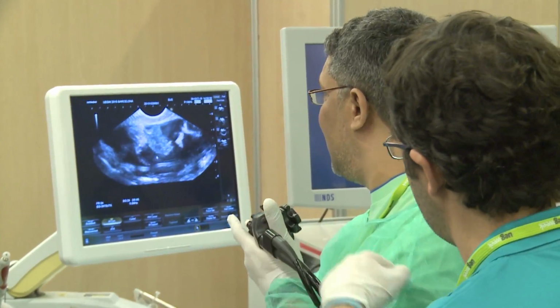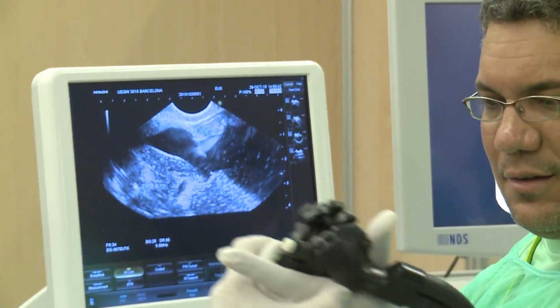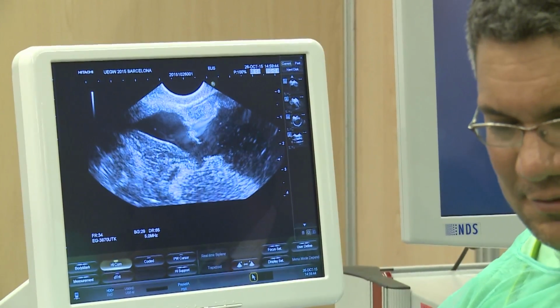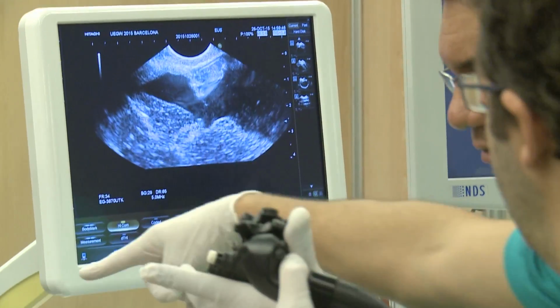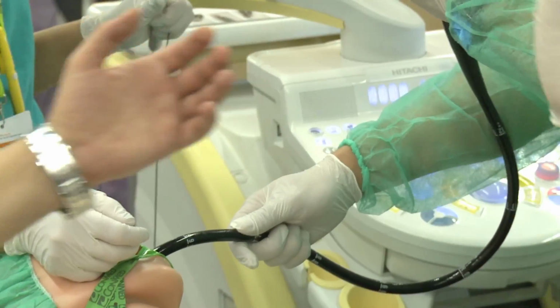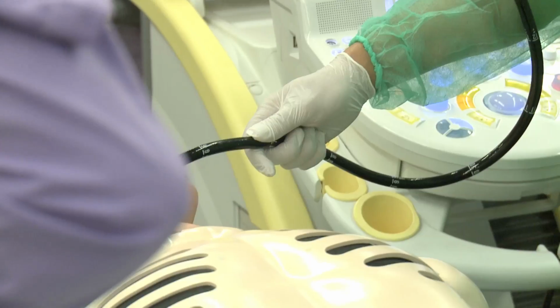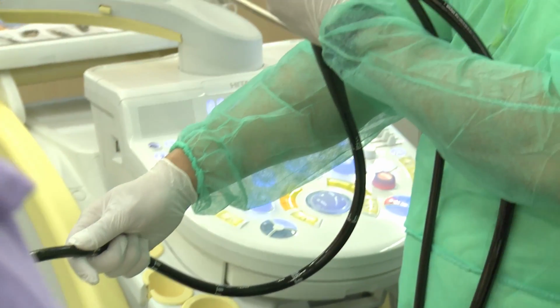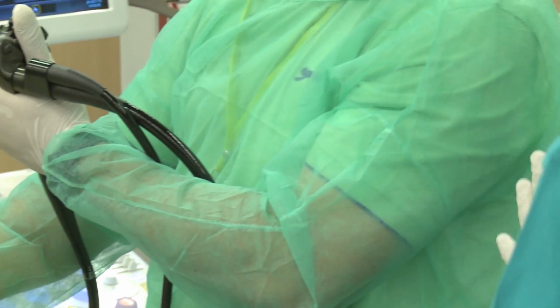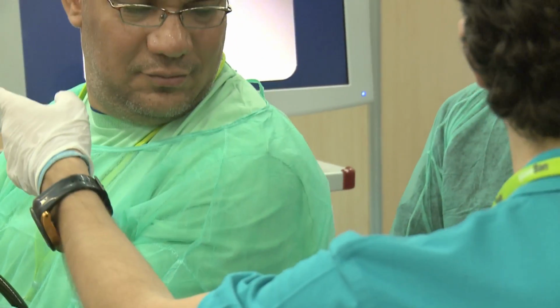And this is an endoscopy, an ERCP position. For EUS, here, and the scope needs to go here. Because the idea is very simple. This is the tip of the scope, okay? My finger is the tip of the scope. And this is the technique of EUS. But again, you need to have an idea of the technique, because if you have the technique, you will be able to find the lesion.